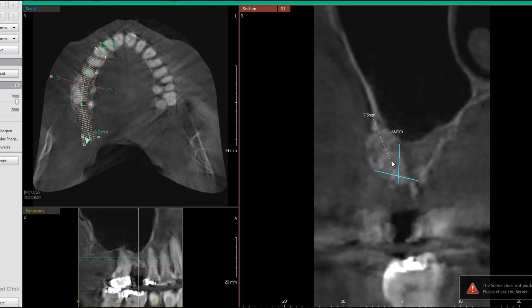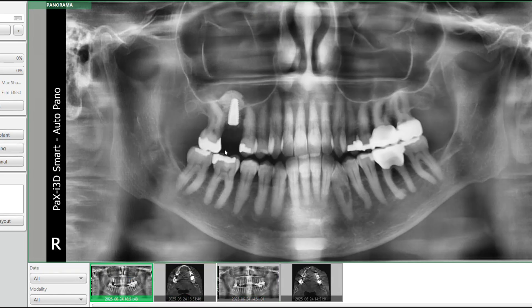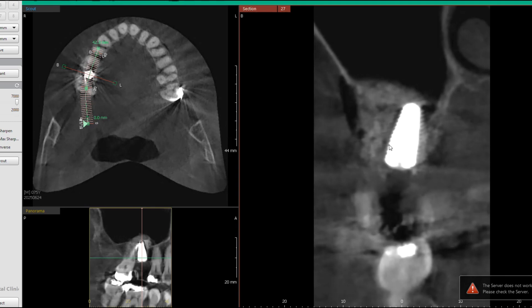Going back to this case — because this patient had really soft bone, I didn't feel we were going to get enough stability for the implant with just seven millimeters of bone height. So what I recommended during the procedure was to go ahead and do a lateral window sinus lift at that time. Here's what it looks like afterwards — you can see all this added bone. I used a combination of bovine bone and human bone. This right here is a zirconia implant because this patient wanted a more holistic approach versus a titanium implant. You can see the sagittal section view where we created the access, added all this bone after lifting the membrane, and then placed the implant.